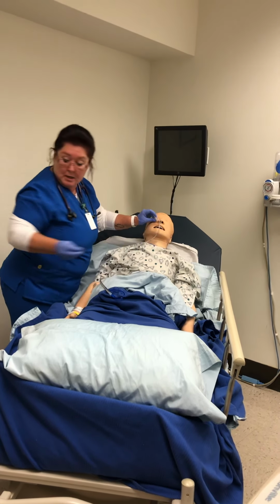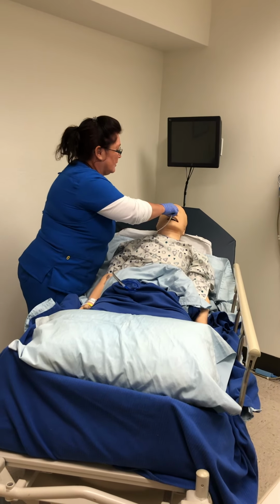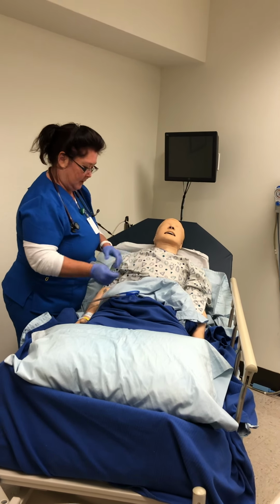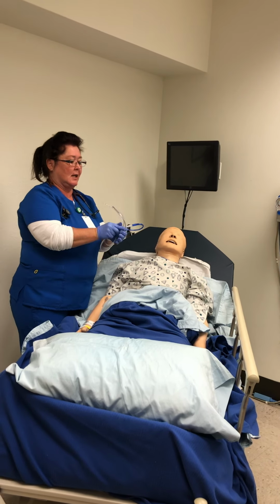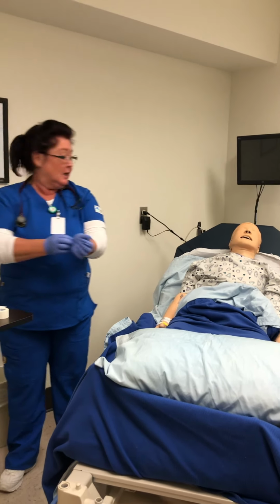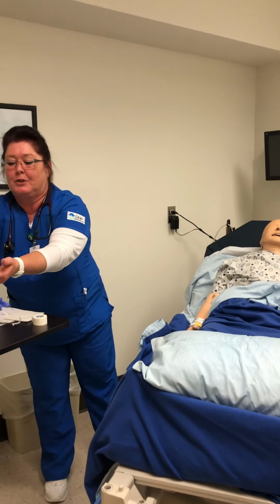Okay, Shirley, now on the count of 3 I need you to hold your breath. Deep breath, hold it, ready? 1, 2, 3. Perfect. And I'm going to take this and I'm going to put it in a biohazard bag. I'm going to take off my gloves. I'm going to do hand hygiene.